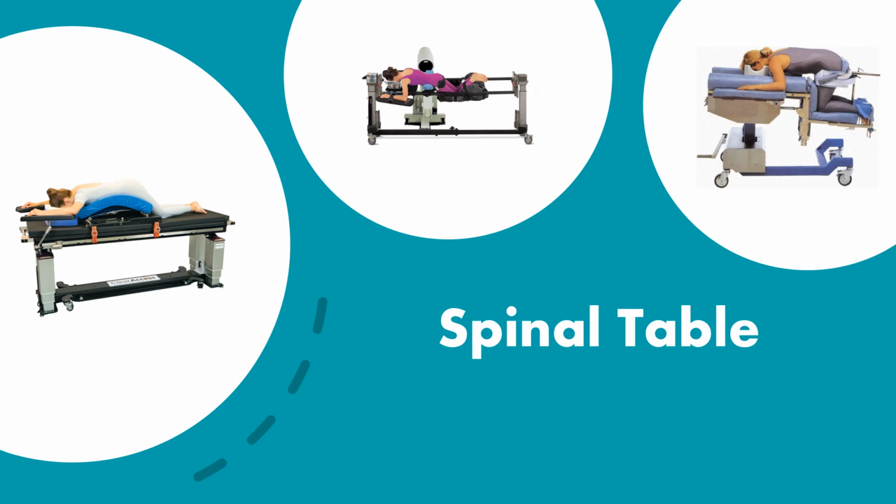images. So this is the spine table. There can be a specific table just devoted to spine, or there can be a positioning device that goes on the existing OR table, which is what I'm familiar with. So that is that.